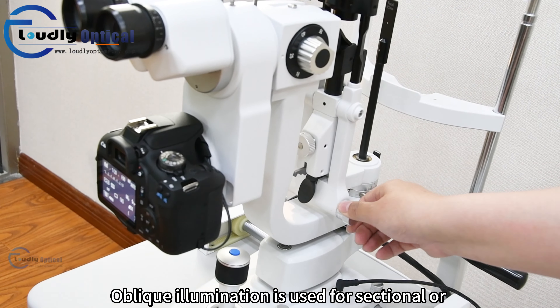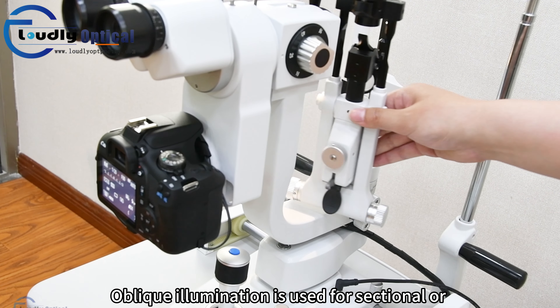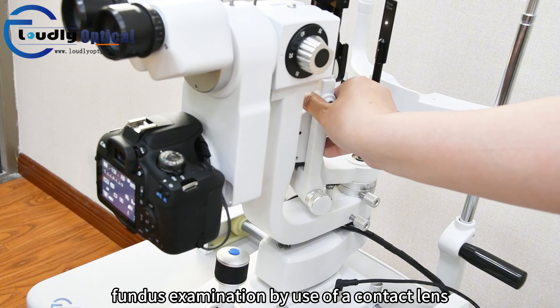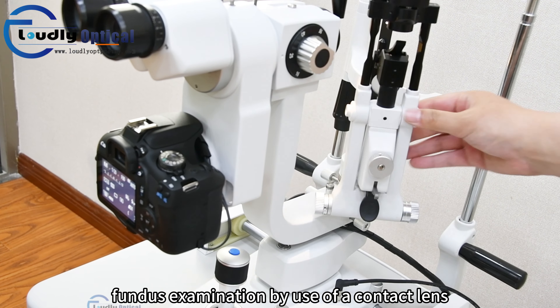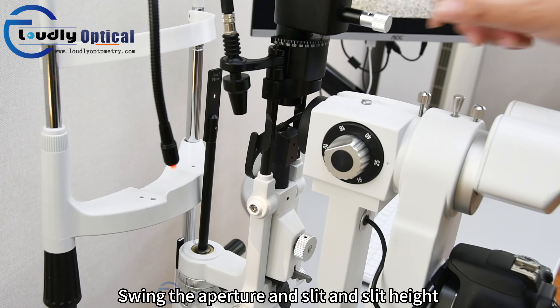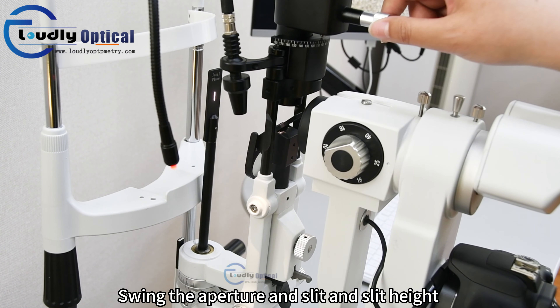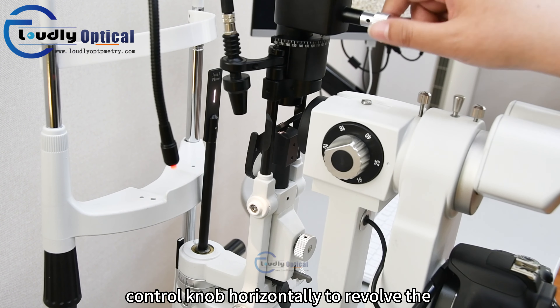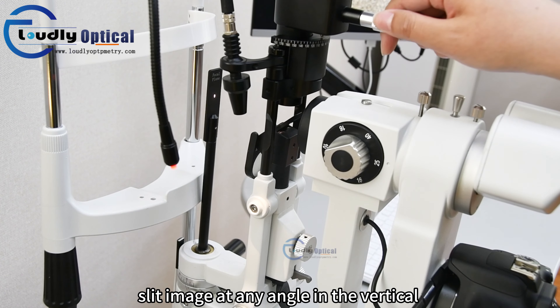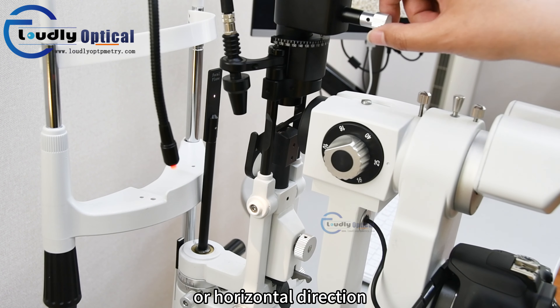Oblique illumination is used for sectional or fundus examination by use of a contact lens. Swing the aperture and slit height control knob horizontally to revolve the slit image at any angle in the vertical or horizontal direction.